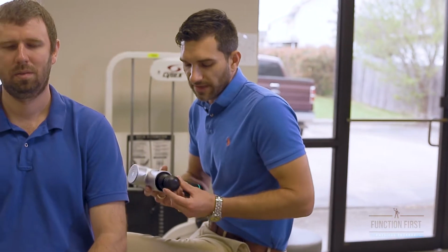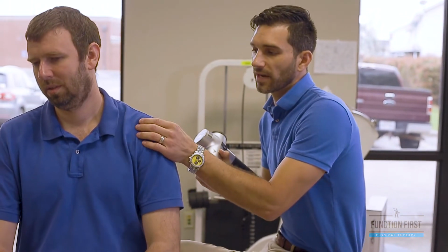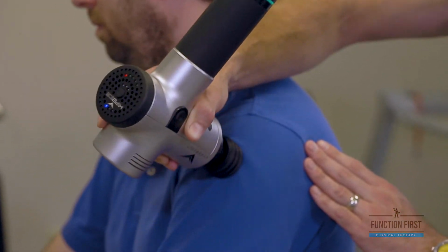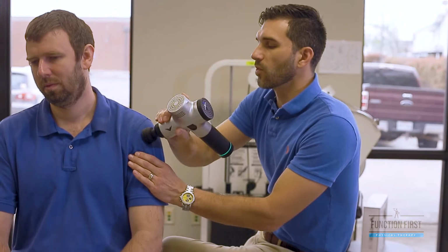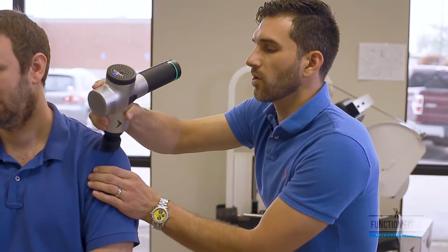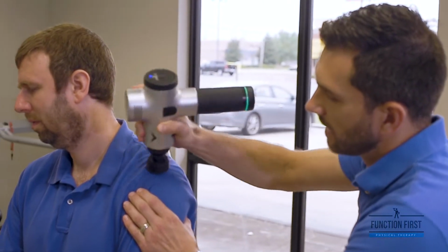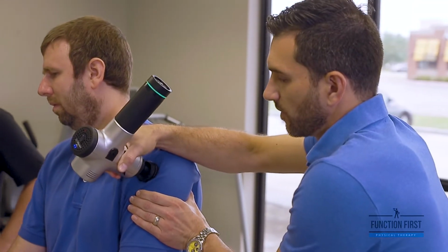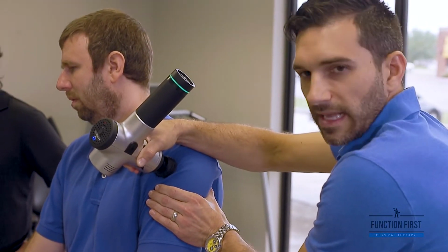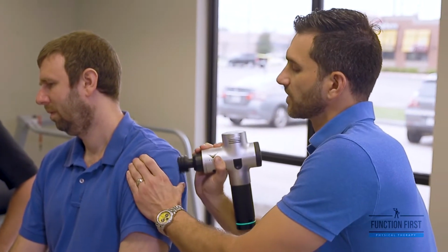Another head we use a lot of is the rubber tip head. It's pretty forgiving, so we like to incorporate this if we need a Hypervolt around a joint or a bony area. We mostly want to stick to the muscle when you run this gun. Let's say if you want a little more power, you can cut it up to level 2, and you can run right over that acromion. You're not going to worry about it skipping off a bone or causing any pain there. And especially if you want to get deep in that joint, just kind of hold some sustained pressure. It does a really good job letting that whole area get some circulation in it.